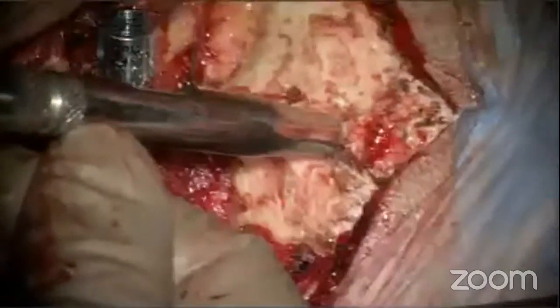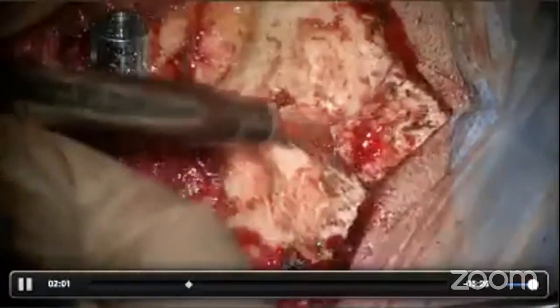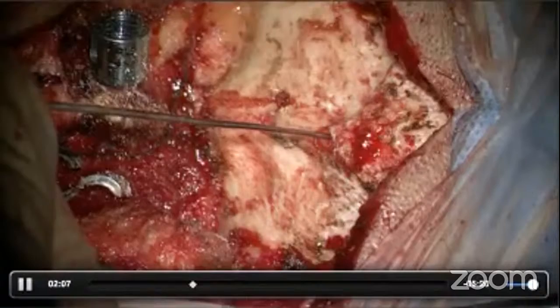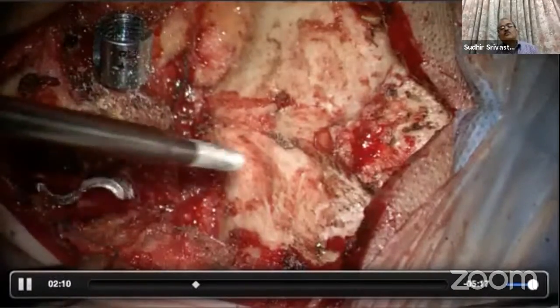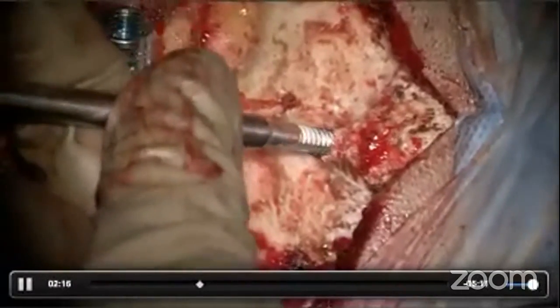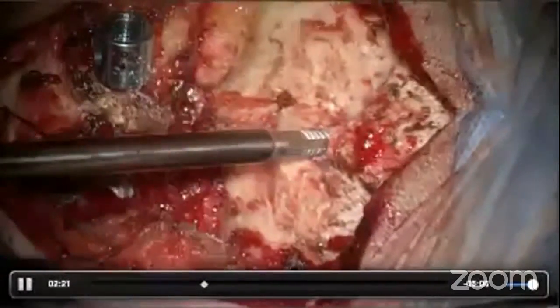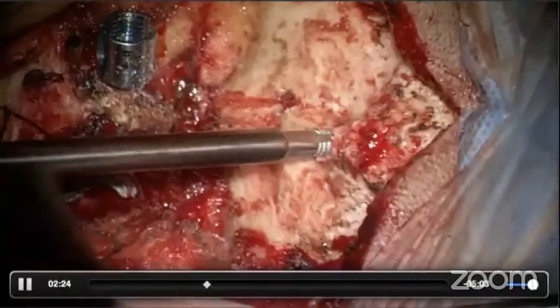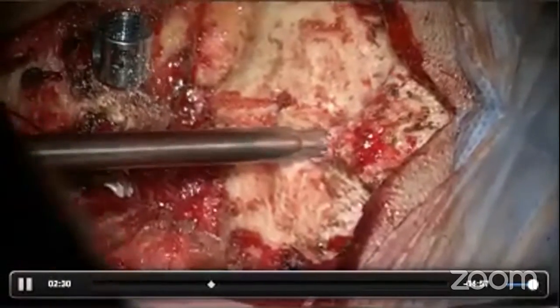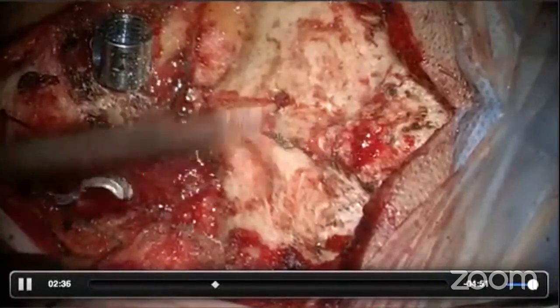If a CSF leak does occur, this can easily be stopped by bone wax or by placing a screw. If by mistake you are at the wrong location and puncture the dural sinus, a similar strategy can be employed. Once the inner table is drilled and a soft feel is noted by the feeler, the hole is tapped through its entire length. It is imperative that the inner table is tapped as well, because if this is not done, the screw tip will abut the inner table and strip away all the tapped threads. This will loosen the screw's purchase considerably, so take the utmost care to ensure that the hole is completely tapped.